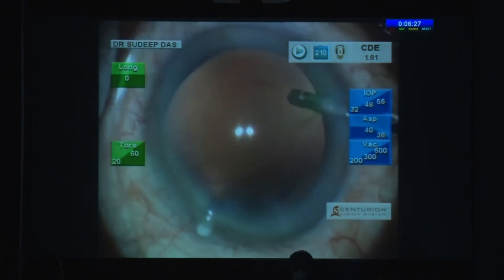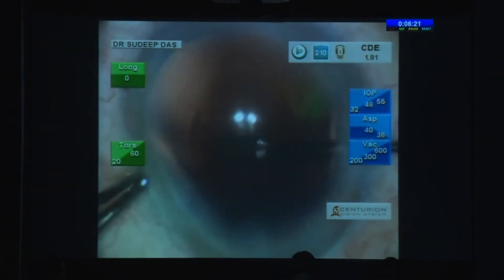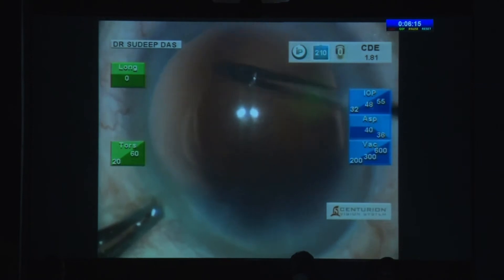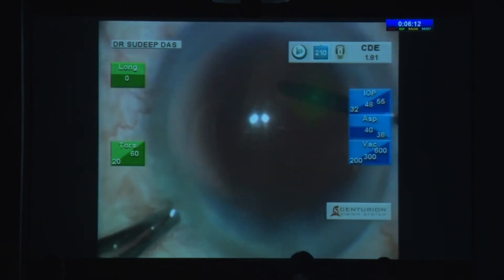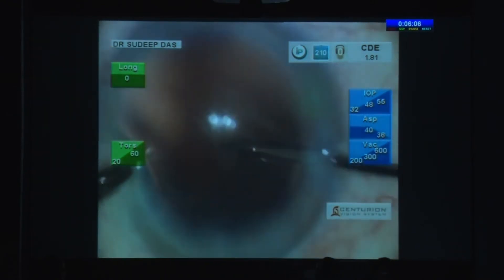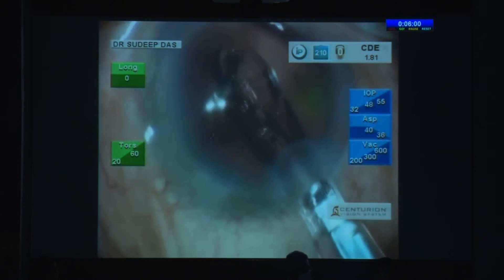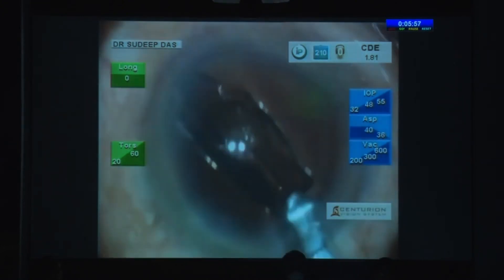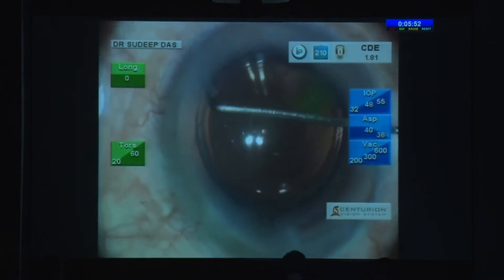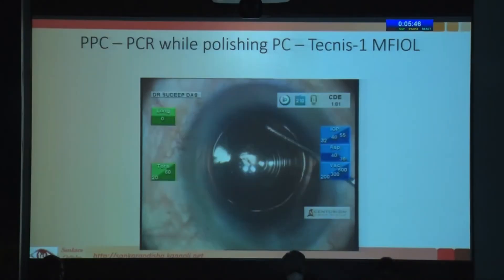I had the sense not to shut off my irrigation. I injected viscoelastic, and this was a small flap-like tear, so I could convert it into a posterior primary posterior capsule rexis. Believe me, it's a lot easier to do a rexis on the posterior capsule than on the anterior capsule — there are no zonules to pull the rexis out. Then you can implant the IOL of your choice. This is a Tecnis 1 multifocal IOL, and it's absolutely stable — it goes between the anterior rexis and the posterior rexis.